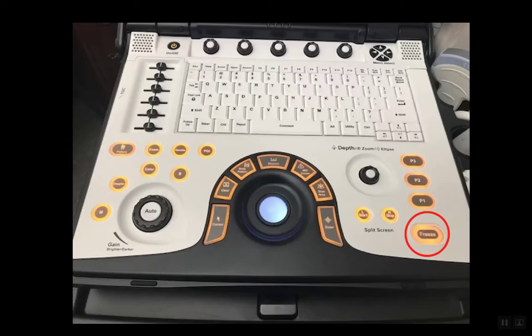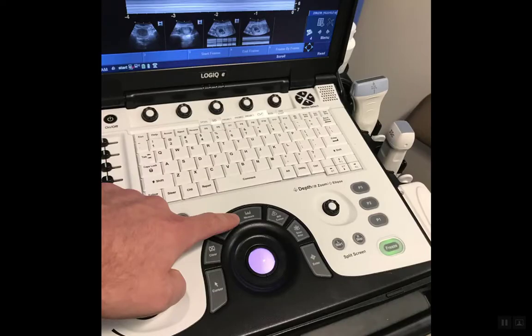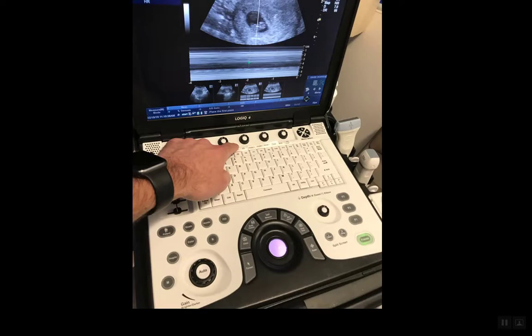You then want to freeze the clip and measure. The last thing you have to do is change to the heart rate preset, because if you just leave it as it is, it's going to measure a distance when you want to measure a heart rate instead.